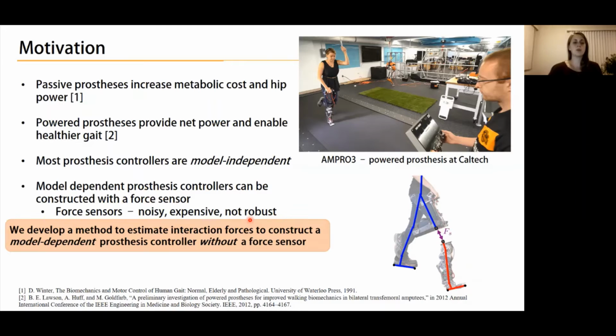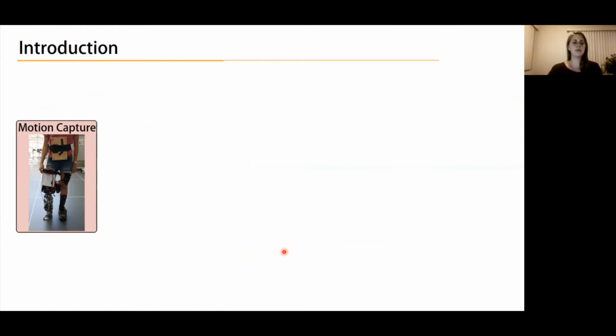Motivated by this, we develop a method to estimate interaction forces to construct a model-dependent prosthesis controller without a force sensor. I will give a brief introduction of our method and then go into more details about each component.